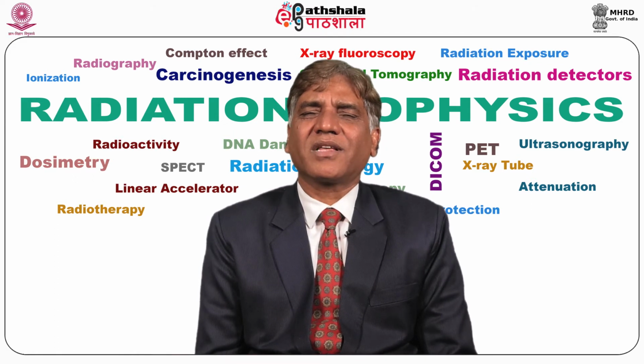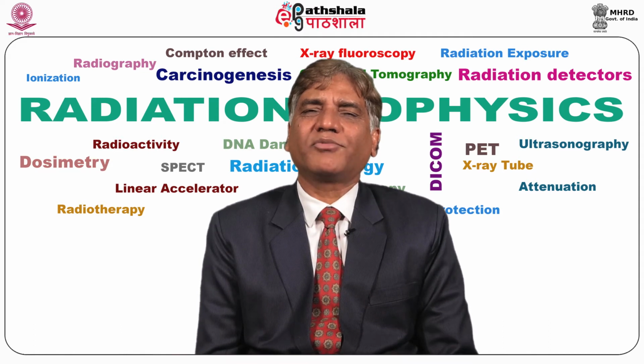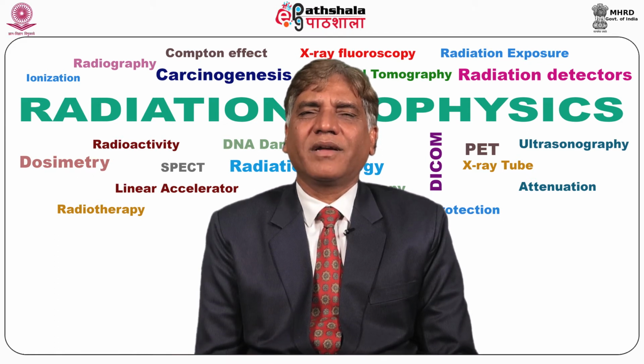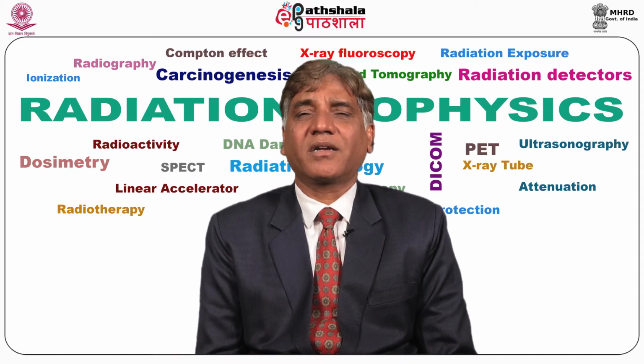This attenuation occurs due to reflection, refraction, scattering and, of course, absorption. So absorption, reflection, and refraction cause the attenuation in the ultrasound beam. When the ultrasound beam interacts with the body tissues, a portion of the ultrasound beam is reflected in the form of echoes, and these echoes are utilized to reconstruct the image in ultrasonography.